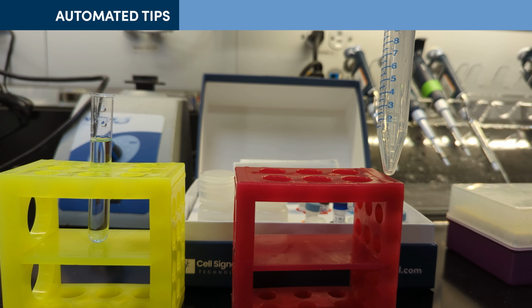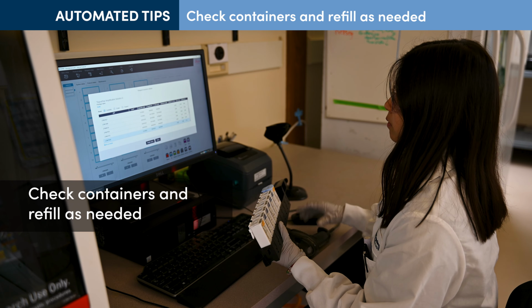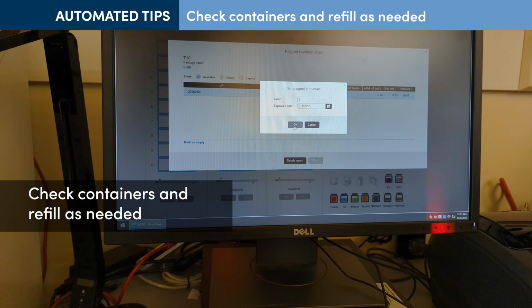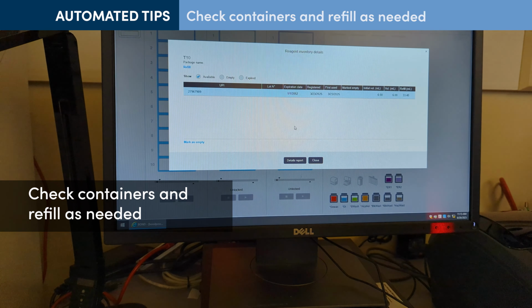Before running, check the reagent containers and refill in the Bond RX software as needed to ensure there will be adequate buffers and reagents. The Bond RX protocol includes a step for antigen retrieval in round 1. This is required only once before round 1, so in round 2, select blank in the menu.